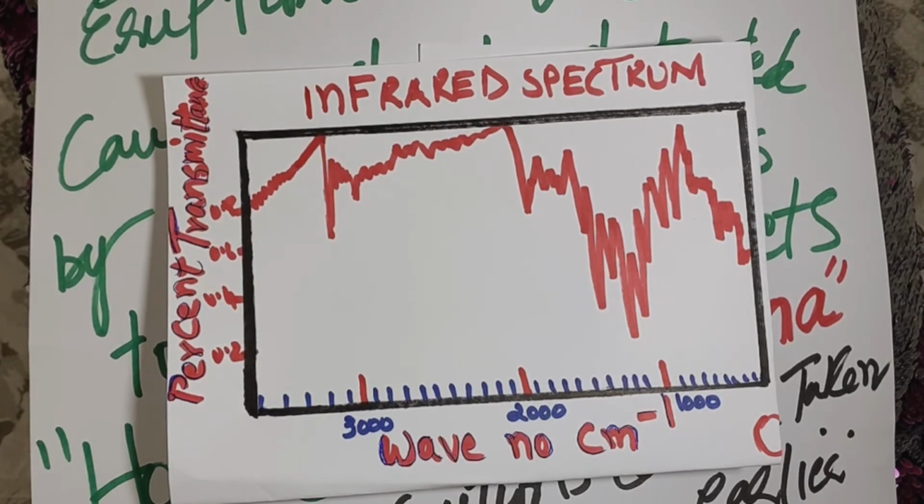Infrared physiotherapy is also a very powerful technique for treating patients who have musculoskeletal pain. What type of pains are these? Of course, the pains in the joints and the spasms that are produced in the muscles, and so it helps to eliminate these pain-related diseases and these muscular spasms. And what is used for that? An infrared lamp is used for this treatment.